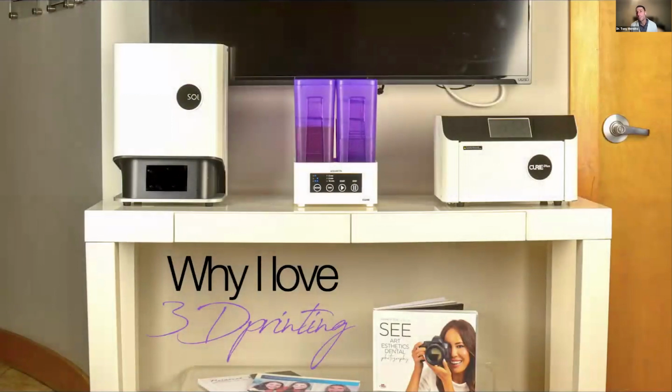Now let's talk about 3D printing. And I didn't mean to poo-poo 3D printing because I do absolutely love it. It's one of my favorite things. And when you buy a 3D printing system, it's really these three pieces that you need. What you see on the left is the printer, the actual printer. In the middle, that purple thing is an alcohol bath. That's where you wash the prints once they come out of the printer.